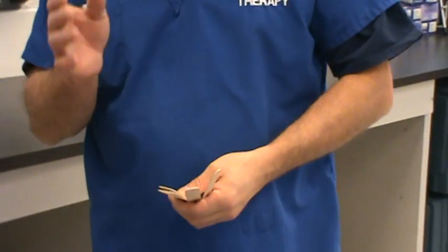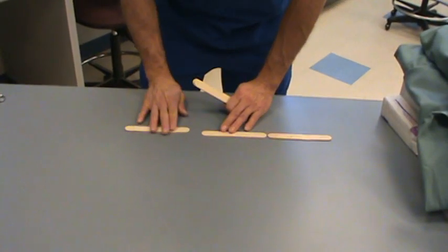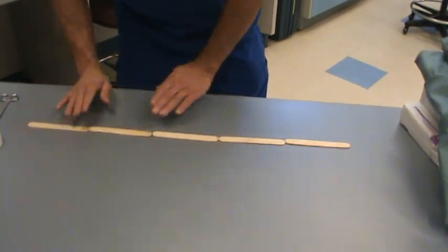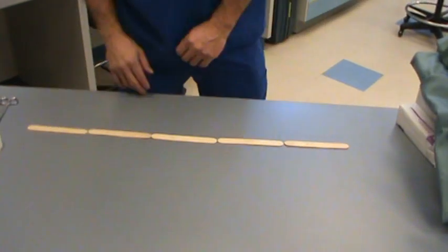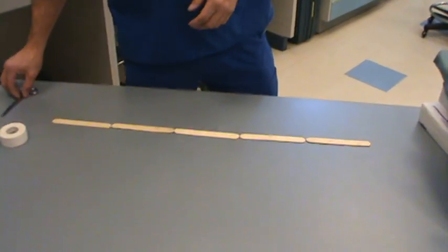So usually you'll grab 5 tongue depressors, and the first thing you'll do is put them on your flat, stable surface, lengthwise, like so. This is a good way to establish the appropriate length that you would need to properly build a set of tapes for intubation. It's simply used as a device to determine the length for an appropriate set of tapes for an average size adult patient.